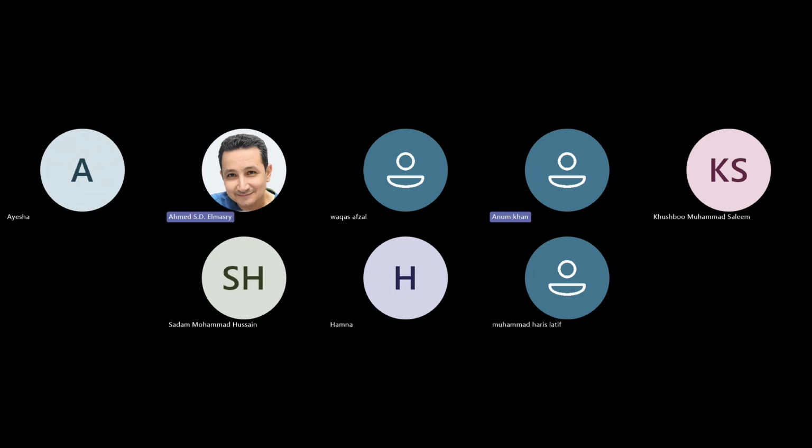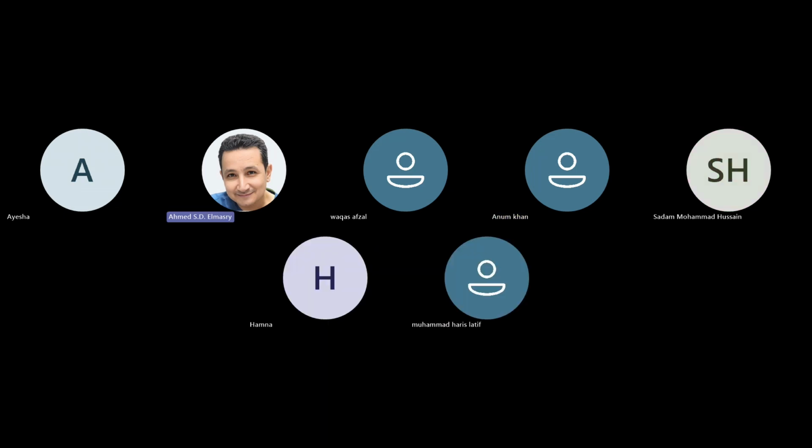There will be little factors as well. They choose helium because it's a very light gas, and it can be absorbed very fast, so the damage from the gas embolism will be very little. The gas embolism might lead to ischemia, because there will be an air column inside the artery and the blood flow will not be maintained to the organs. If it went to the heart, it might lead to arrhythmia, turbulence of the blood flow.